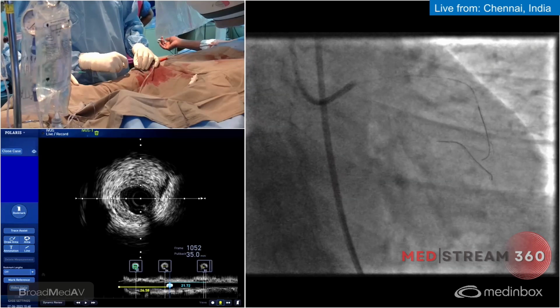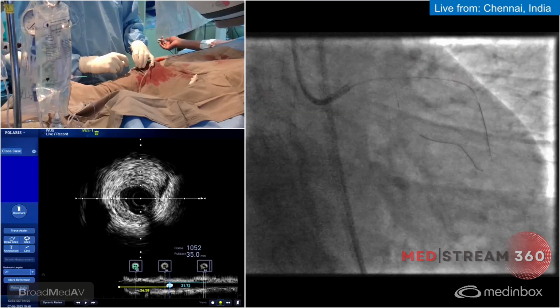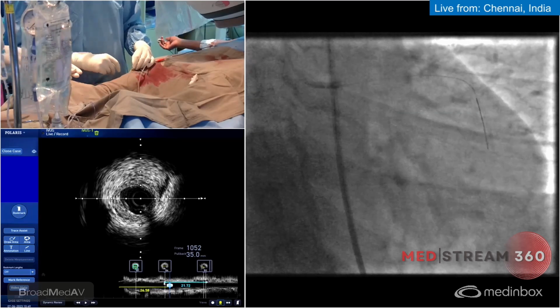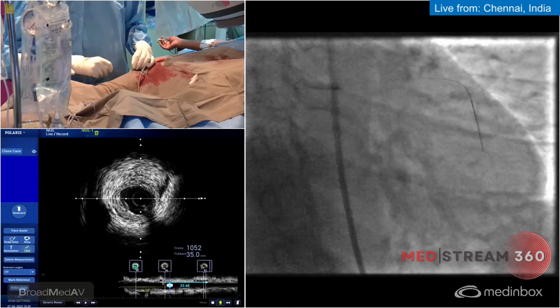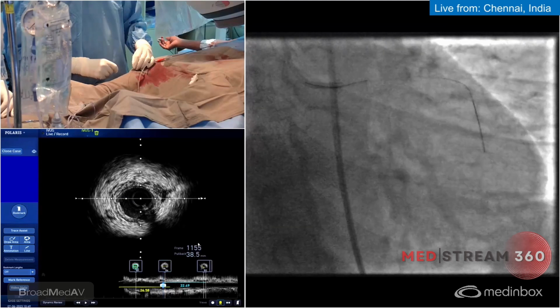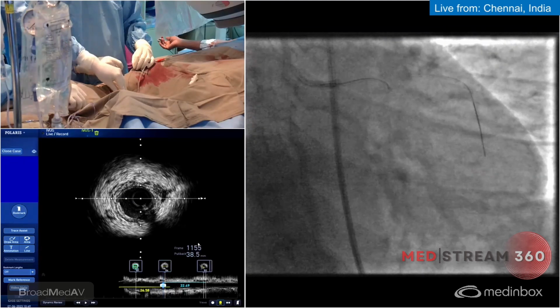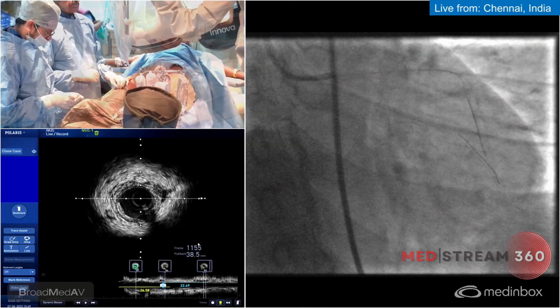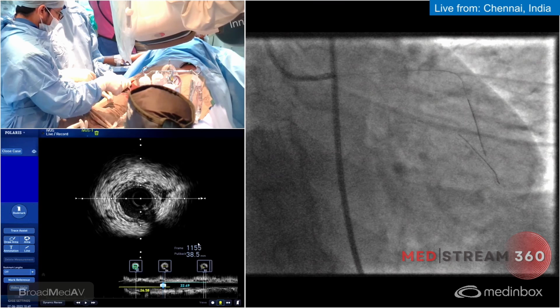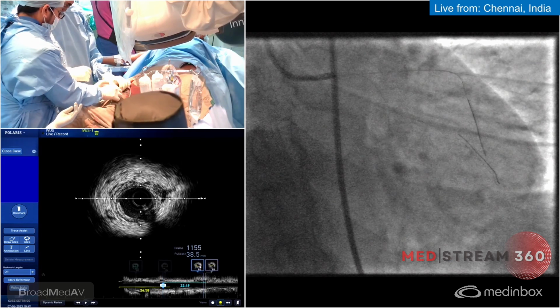We could use a cutting balloon, but when you have these small vessels, it's extremely important that you don't lose the LAD wire now and all this confusion. So it's extremely important that your fingers are holding the LAD. And now I'm going to rewire, small check. And then we'll fix, after we do the OM, as Dr. Nandakumar said, we'll use two stents.